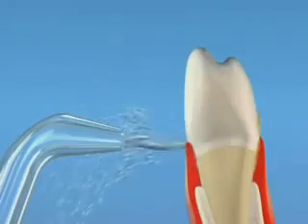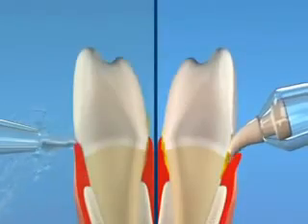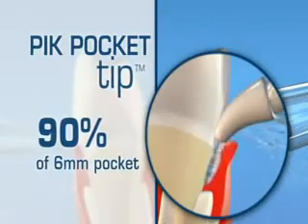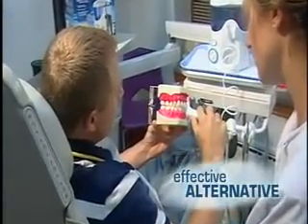So there's no question that it works. The standard jet tip reaches on average 50% of the pocket depth. For periodontal patients, the pik pocket tip is proven to reach up to 90% of a 6mm pocket. The end result? An easier and more effective alternative to flossing and greater compliance.